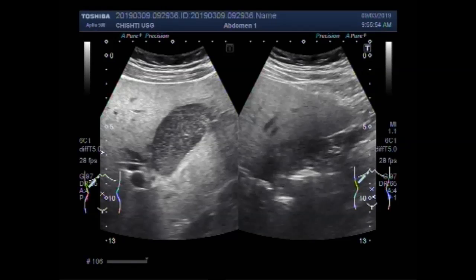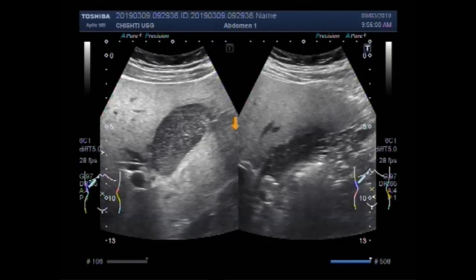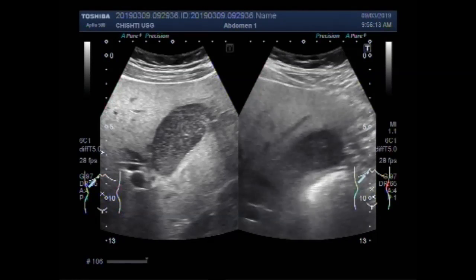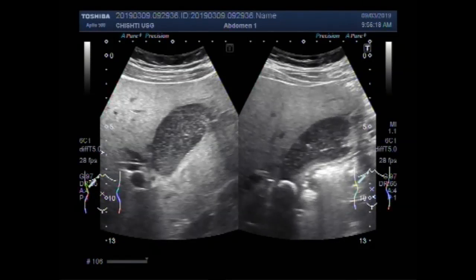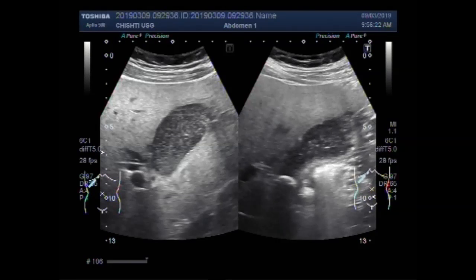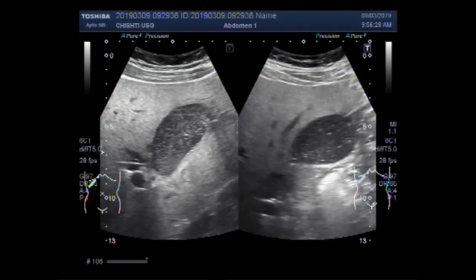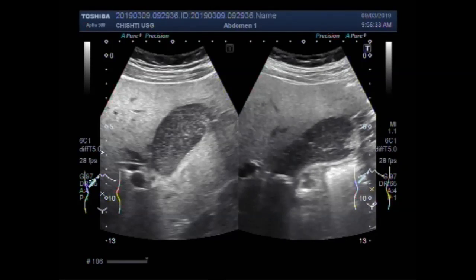You can see a large stone seen in the neck of the gallbladder. This is the stone and this is the gallbladder.